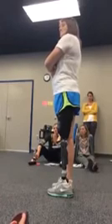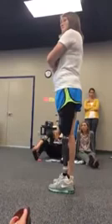So is she keeping her toe down? And is she getting good knee flexion as she comes through? The heel rise, from my perspective, looks good. You can see the bottom of both of the feet. From the back, you can look at the bottoms of the feet and see how much of the bottoms of the feet you can see.